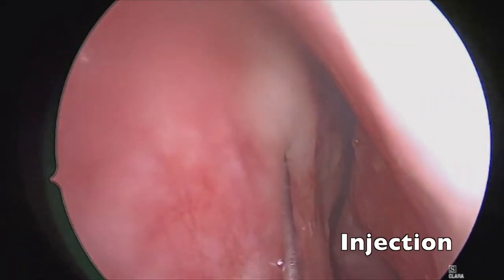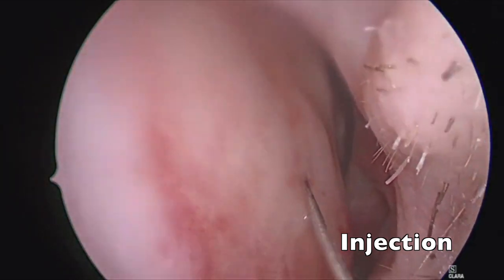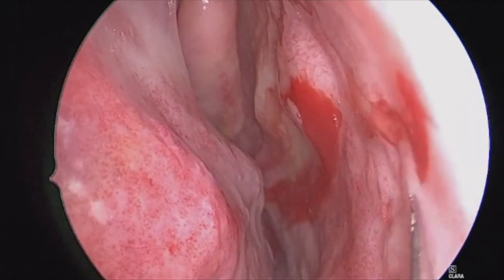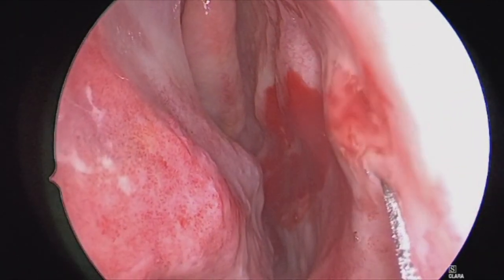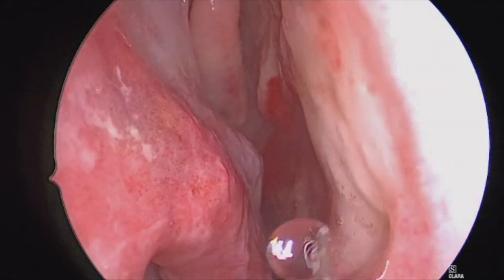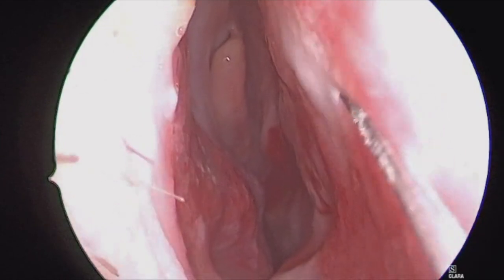For these cases, I will typically infiltrate local anesthetic. This is 1% lidocaine with 1 to 100,000 epinephrine. Here we are injecting in multiple points on the left side and then also injecting on the contralateral side. Ideally, you will have this injection directly against the cartilage in a submucoperichondral plane to be able to lift that away for raising the flaps in the near future.